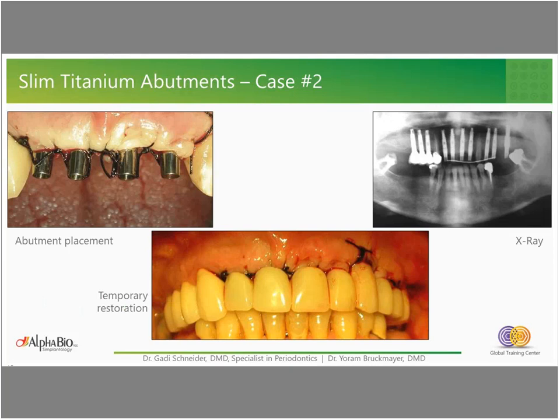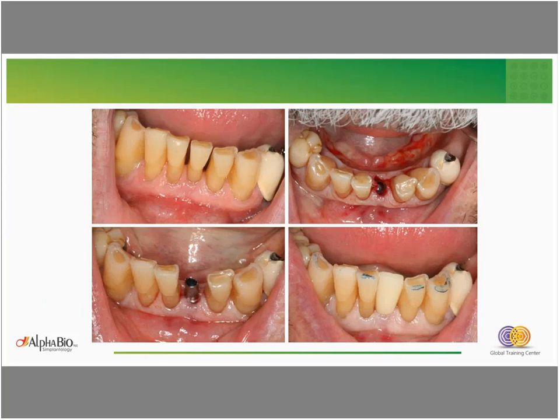The anterior area of the mandible can also be challenging when we have a limited interdental area. We are talking about a few millimeters that can be the space in which we decide which implant to place and which abutment to use. In these cases, narrow implants can be a good solution in order to be at safe distances between the adjacent natural teeth.